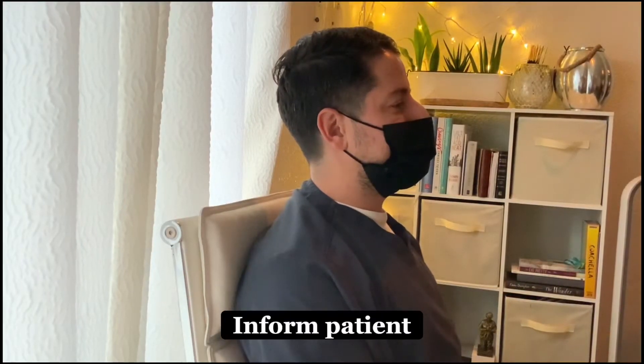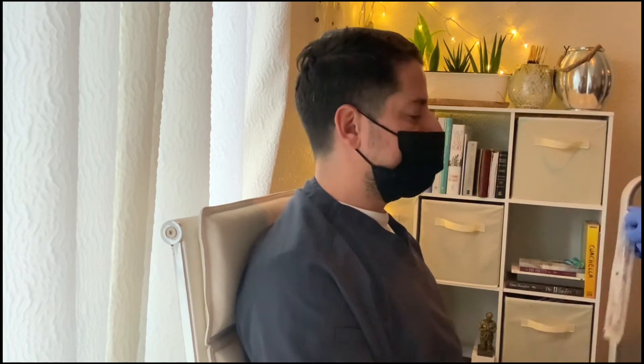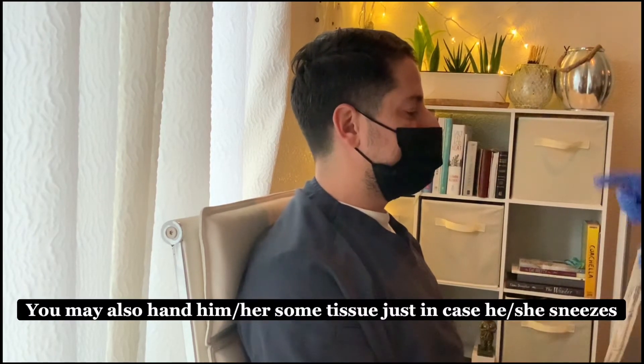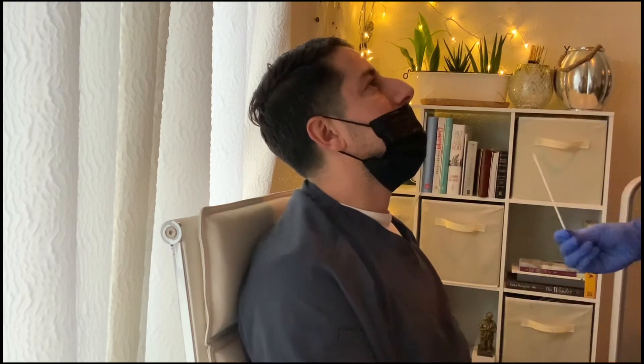Next you're going to inform your patient what you're going to do. He or she should already know, but just in case. Also hand some tissue if he or she needs some tissue. Gently lower the mask down just beneath the nose, so if he or she sneezes, it's not all over you.